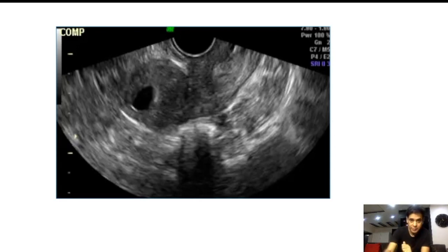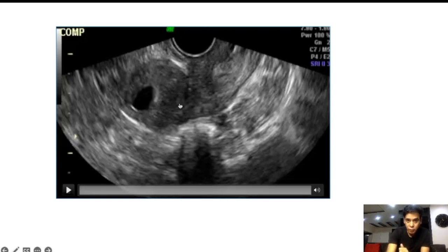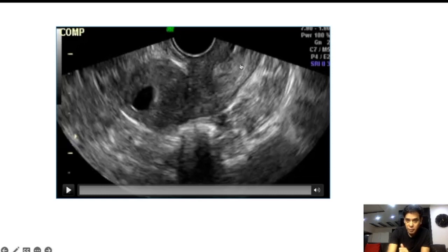Let us see this case. In the still picture, it looks almost like a sac-like area within the uterine cavity. This is the uterus here, this is the isthmus part, and then the cervix. Let us play the video and you will get a better picture.